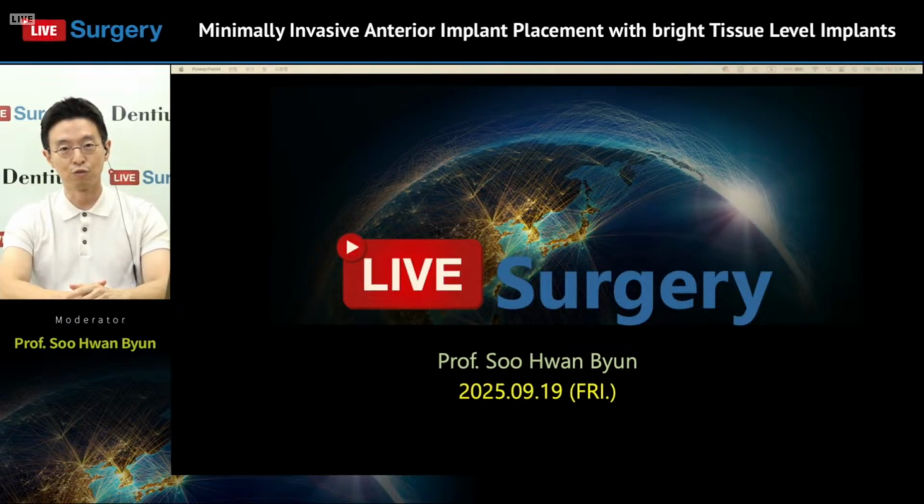I'm Professor Soo-Hwan Byun. It's a great pleasure to be here with you on today's live broadcast for live surgery. Today's live surgery is taking place on Friday, September 19th, 2025. I'm the moderator and operator of today's live surgery.